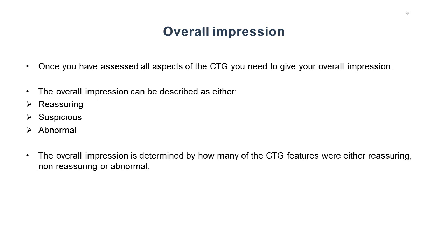Overall impression. Once you have assessed all aspects of the CTG, you need to give your overall impression. The overall impression can be described as either reassuring, suspicious, or abnormal. The overall impression is determined by how many of the CTG features were either reassuring, non-reassuring or abnormal.